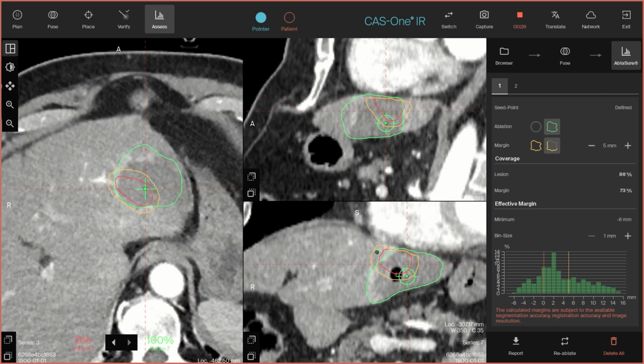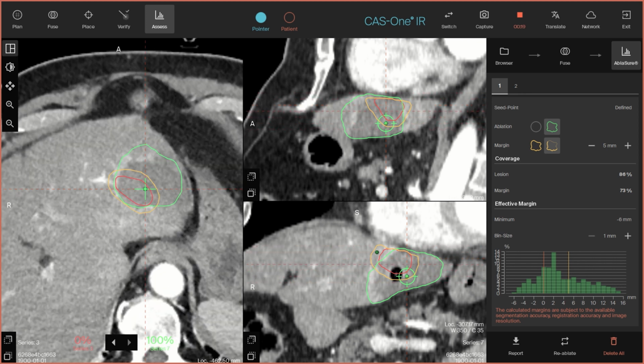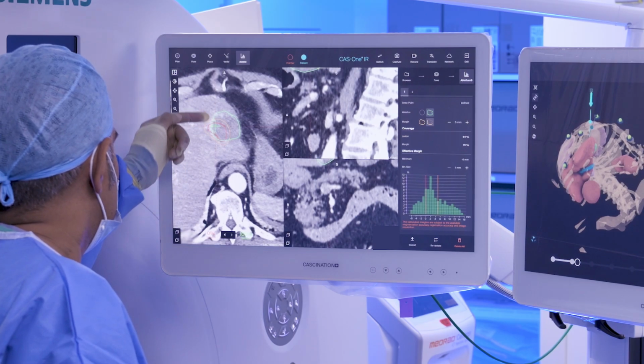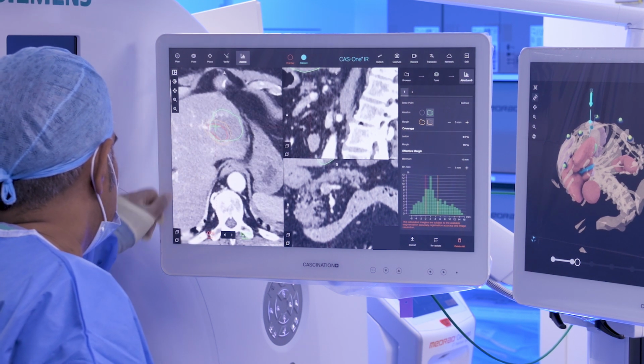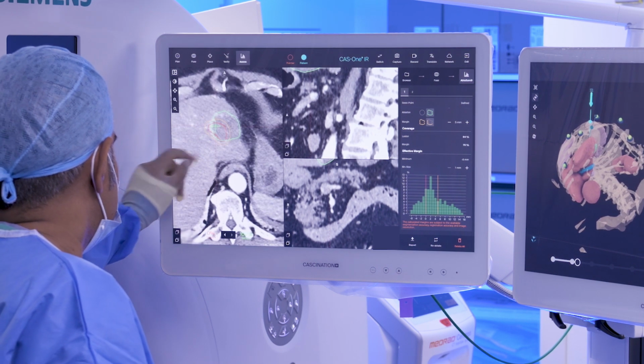And so we can see what has been segmented in the ablation zone is not covering the tumor, but the question is whether that segmentation is truly the full representation of the ablation zone. What you can see is this subtle high attenuation area, which there's obviously a vessel here, but the question is whether this is part of the ablation cavity.